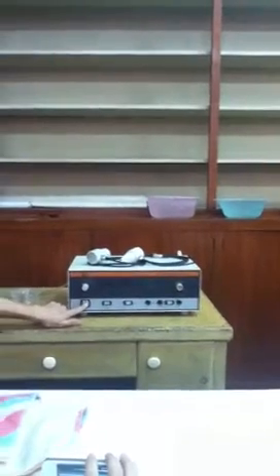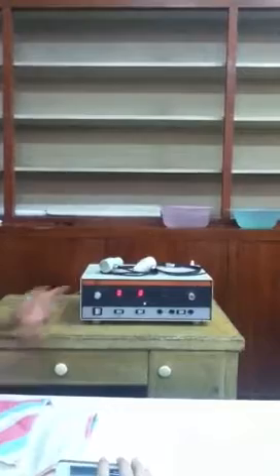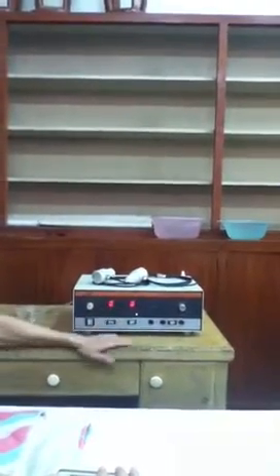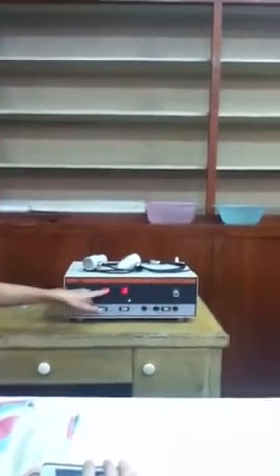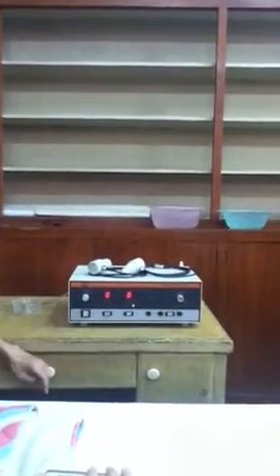Plug it in. There, you will hear the sound. If a 0, 0 appears, that indicates the inside of the machine is functioning well. If a horizontal line appears, that indicates there's something wrong with the machine.